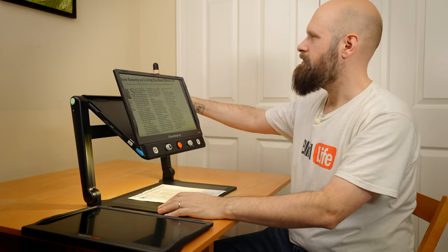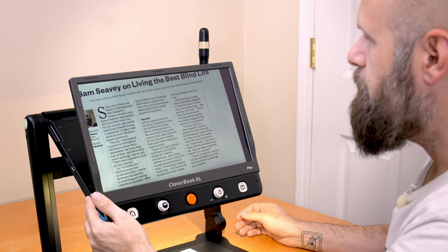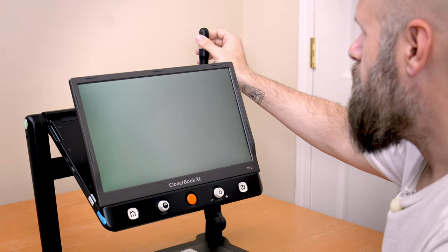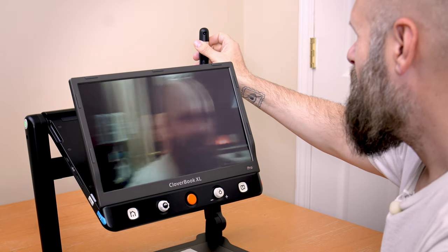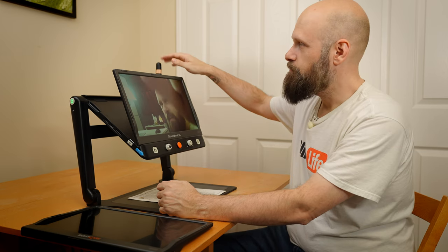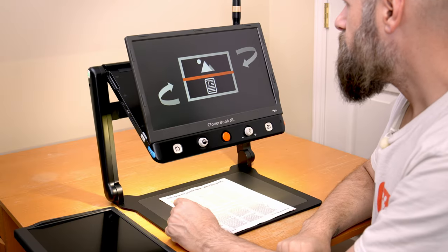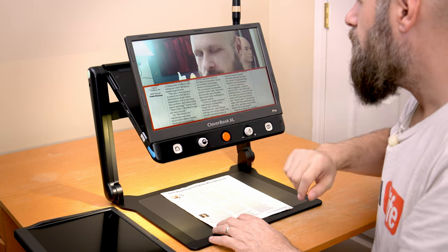The device also has a distance camera on the far right. To switch to it, tap the uppermost button on the left side — it switches to distance view. Turning it toward me shows a mirror view. All the same rules apply: pinch to zoom, change colors. If I want to see both the document and a distant view at the same time — say I'm in class and need to see the teacher writing on the board while filling out paperwork — tapping that same button again activates horizontal split screen. Now the lower half shows my document and the upper half shows the distance camera.